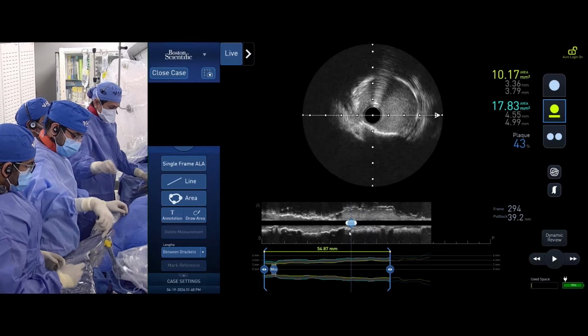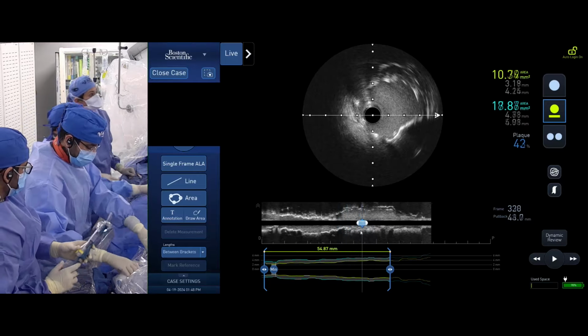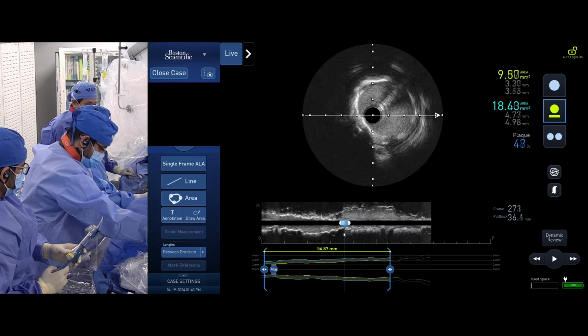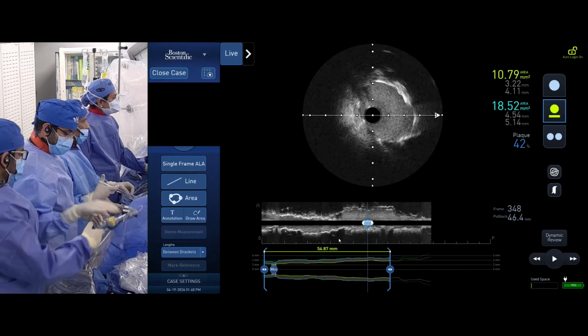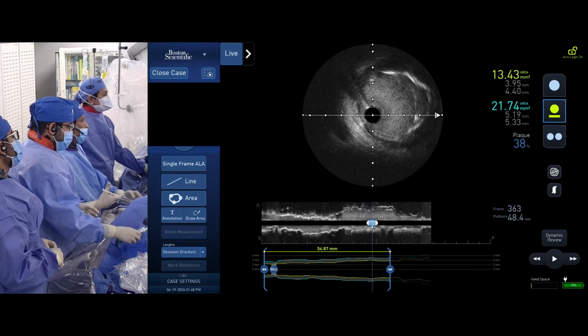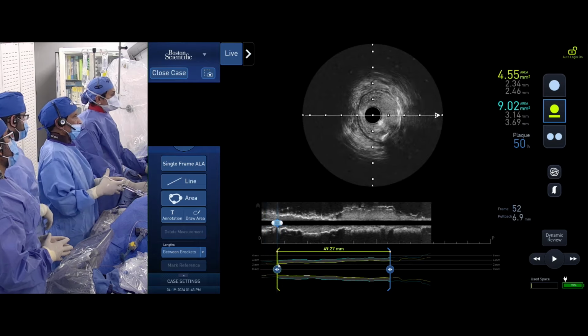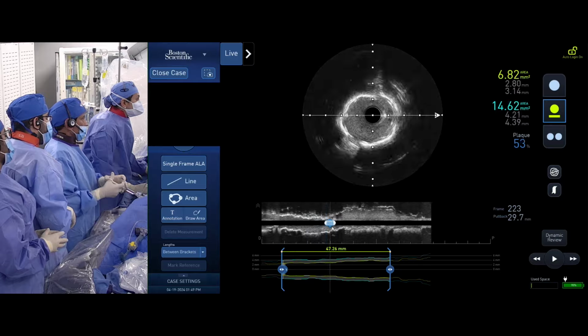And I'll show you the tightest part. Looks like we lost the nodule. Nodule is bye-bye. Yeah, area is like a 10. Yeah, no, the area looks good. There is little malapposition on one side, but in calcium, you cannot make it perfect. So this is an illustration that you don't take a balloon and try to make it look perfect, because that's when you do rupture. So it looks very nice.